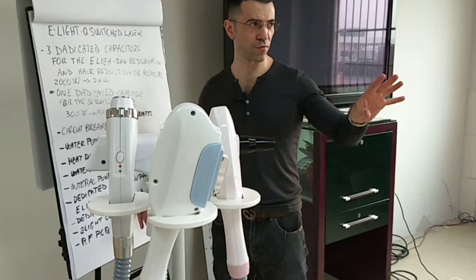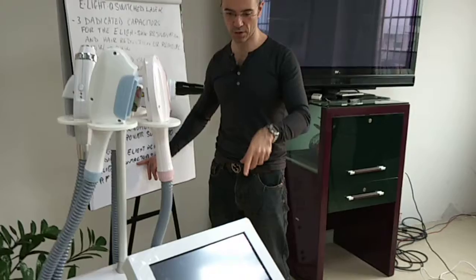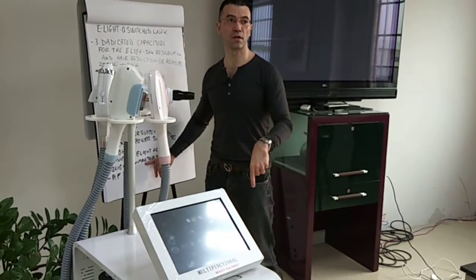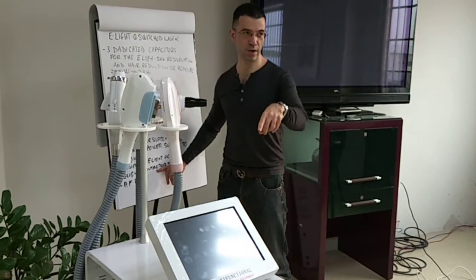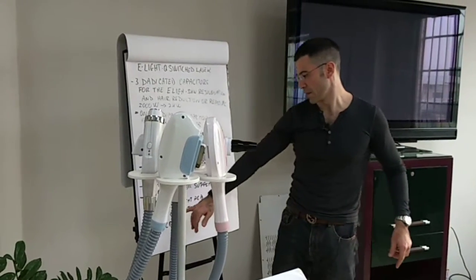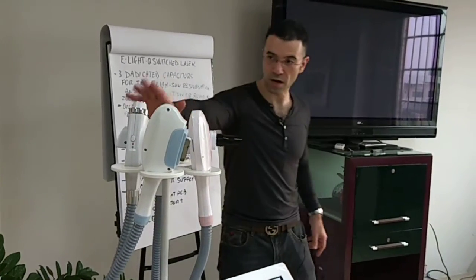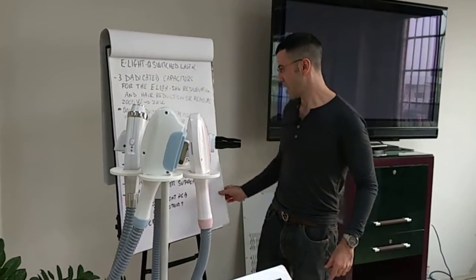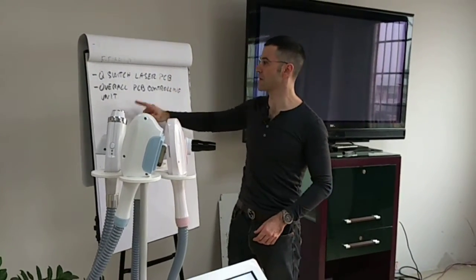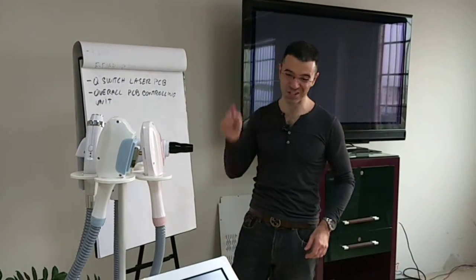If you're familiar with the design of devices, then you know that contactors are required for the functioning of this unit. And as you operate it, you hear the clicking of the contactors when you press ready for these 2 particular heads. Then we've got an RF PCB, a dedicated RF PCB. The RF head is this one. And lastly, the Q-switch laser PCB and the overall PCB controlling unit, which we're going to show you right now.